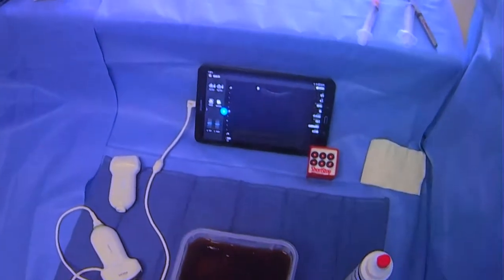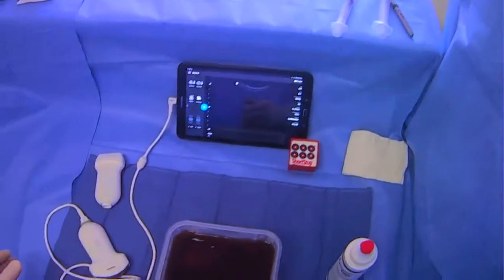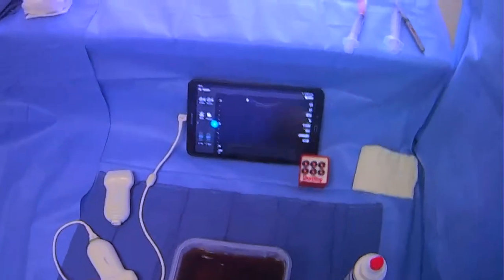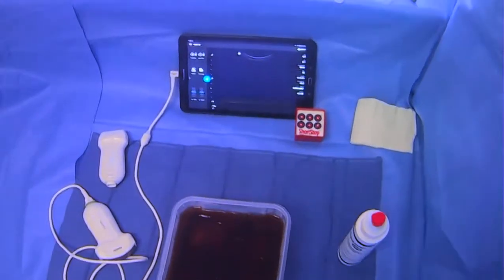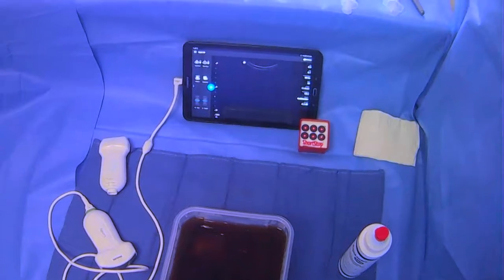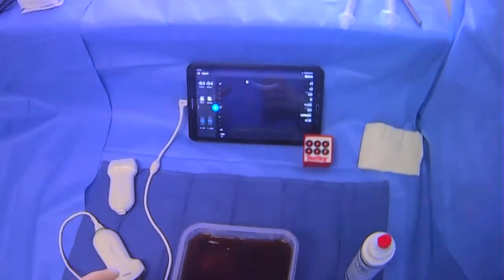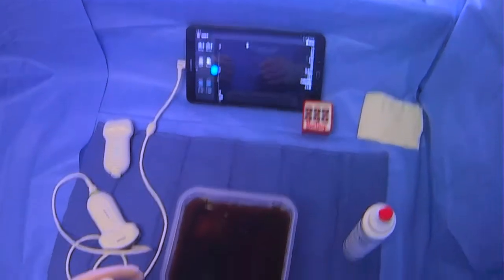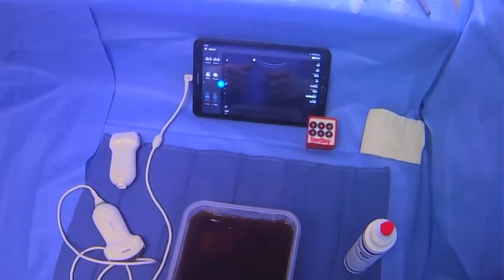We're going to go over how to scan for ascites before you set up for a paracentesis. Ideally, you'd be doing this before you prep the patient so you can figure out where exactly to prep. For the purposes of this demonstration, we're using a small model, so we're limited. But in real life, you're going to be scanning pretty much the whole abdomen to find a good pocket of ascites to drain for your paracentesis.